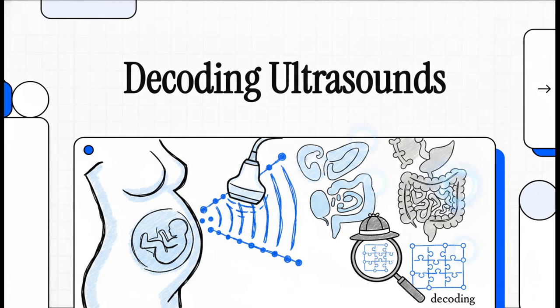When we're staring at an ultrasound monitor, it is incredibly easy to believe we're looking through this real-time, totally transparent window straight into our patient's body. But the truth? Well, it's actually a lot more fascinating and, honestly, a little bit deceptive. Today, we're diving into the pretty wild concept that ultrasound images are very often complex illusions. They're basically biological hallucinations painted by a computer.